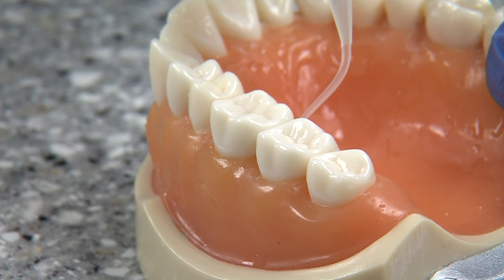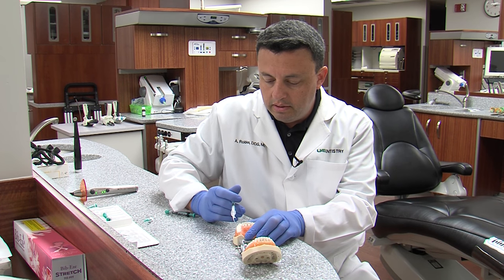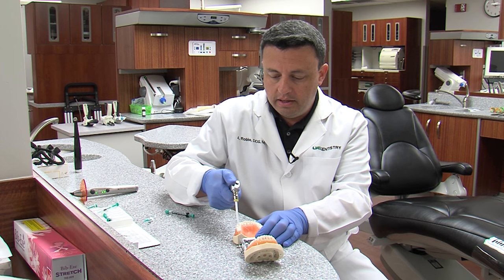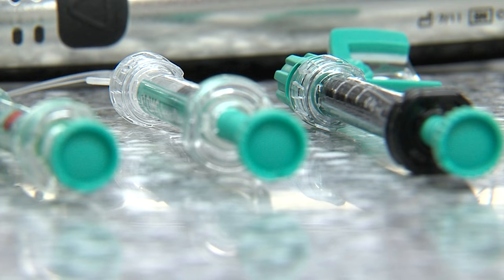Once it's super dry, the system will be able to accept the resin very nicely. We can start drying the alcohol, which will keep the surface very dry and very receptive to our system. The next step is to apply the resin.